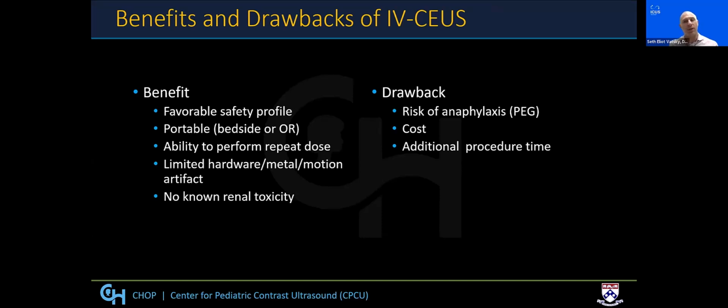Again, the benefits of IV contrast-enhanced ultrasound include the favorable safety profile, the portability, the ability to perform repeat dosing, there's limited motion artifact, and then even with hardware, a lot of times you can reposition your ultrasound probe around that area, and the absence of renal toxicity.